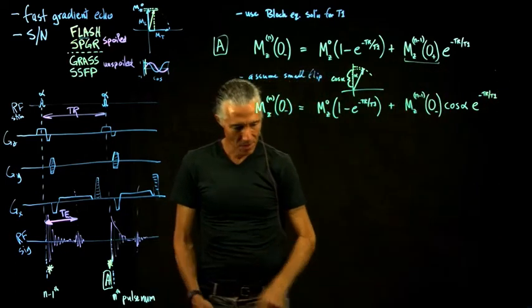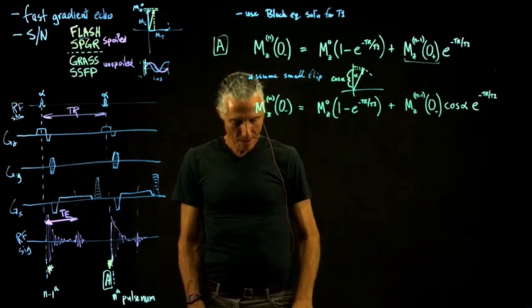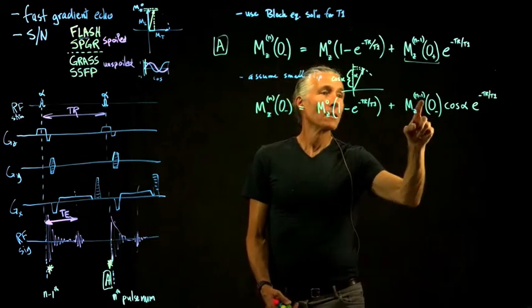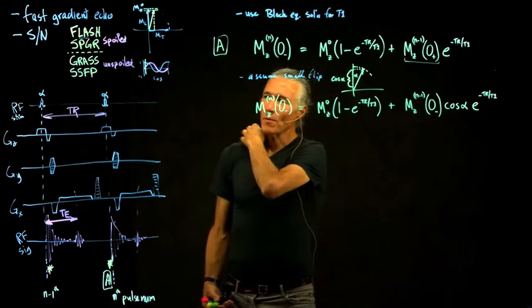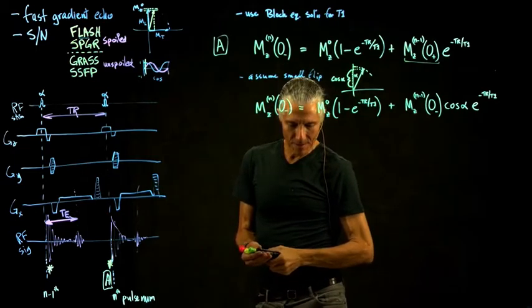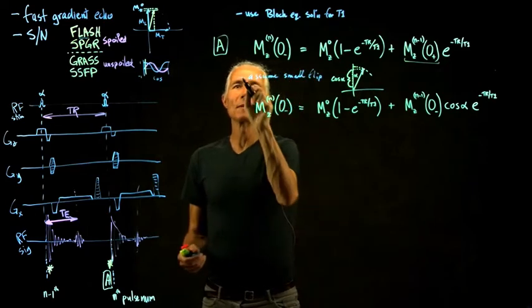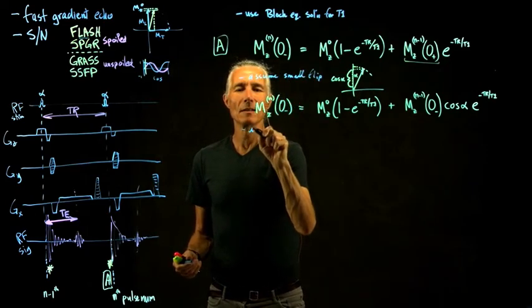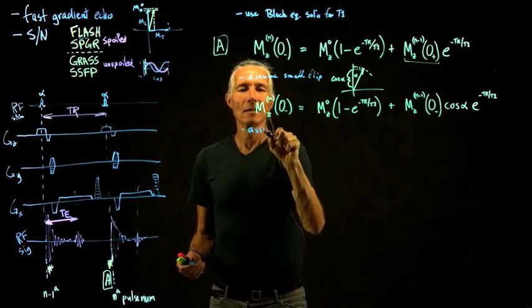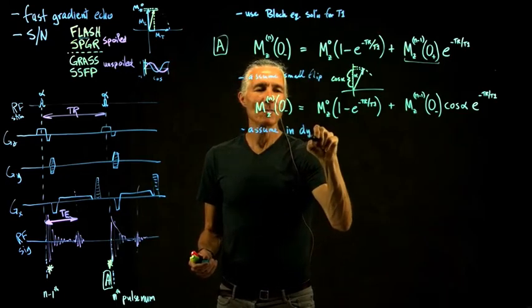Okay, so we still have a lot of unknowns here, but the way we solve the problem now is we just assume we're in dynamic equilibrium.